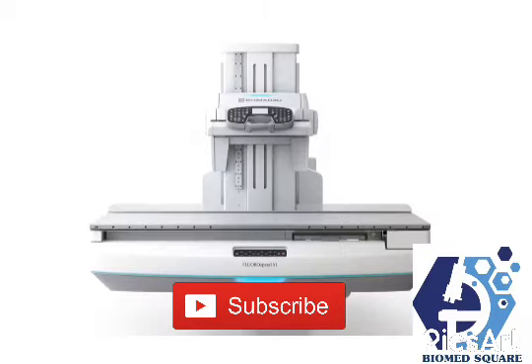Digital fluoroscopy is similar to conventional fluoroscopy, except digital fluoro uses the tube like in normal radiography. Instead of conventional fluoro's 5 mA, digital fluoro uses mA in the hundreds. Dose to the patient is reduced, however, because the tube pulses radiation instead of a constant stream. Digital fluoro machines can reduce patient dose by about 50%.